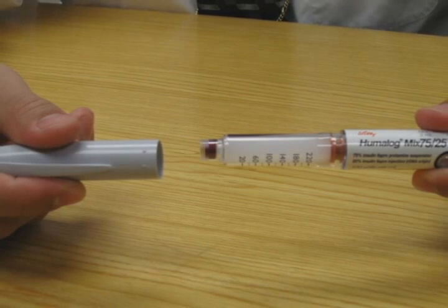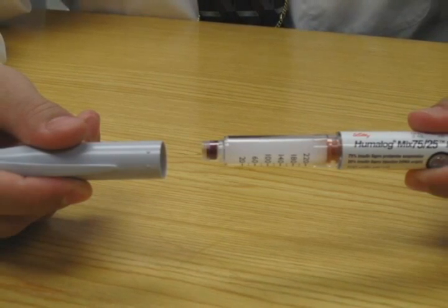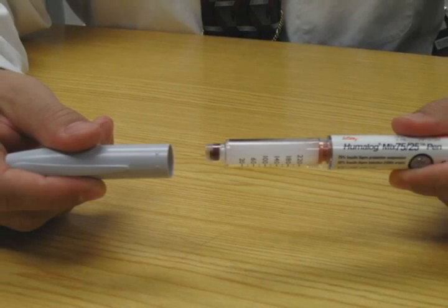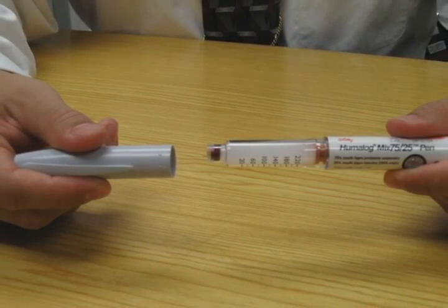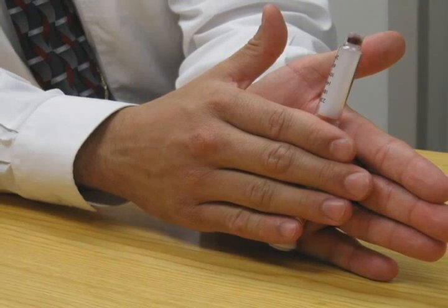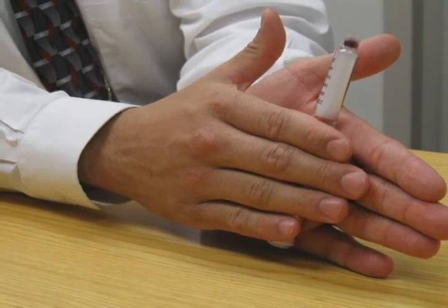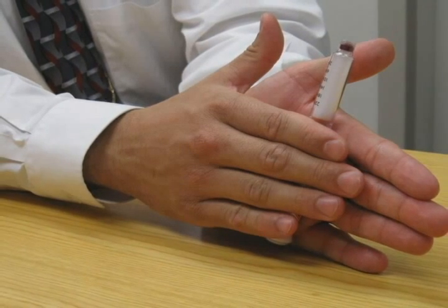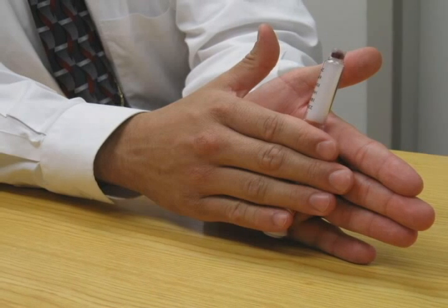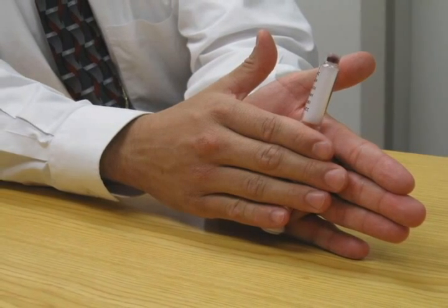Pull the pen cap to remove it. Be sure to check your insulin for type and expiration date. Use an alcohol swab to wipe the rubber seal on the end of the cartridge holder. As with the insulin vials, some insulin available in pens needs to be mixed. Gently roll the pen ten times and invert the pen ten times if you have the cloudy type of insulin. Do not shake the pen.